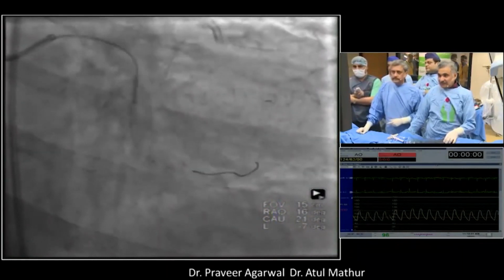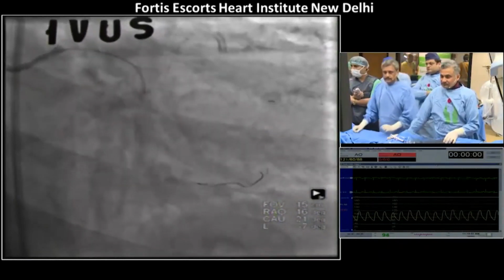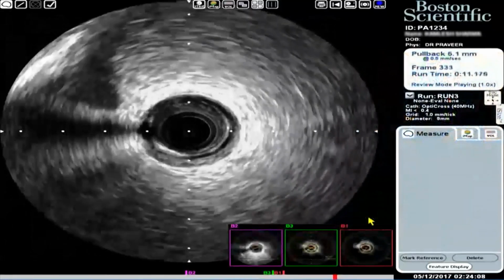So now the IVAS, we will show the IVAS run. Yes. Yeah. Okay, you can go live. Want to speak? Can you show the IVUS, please? Can you show? Yeah, restart the IVUS.